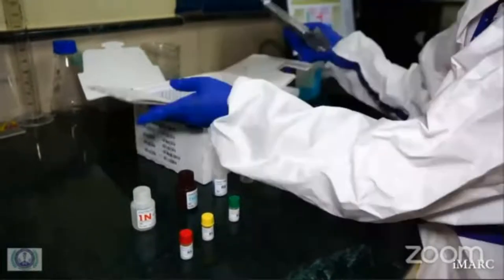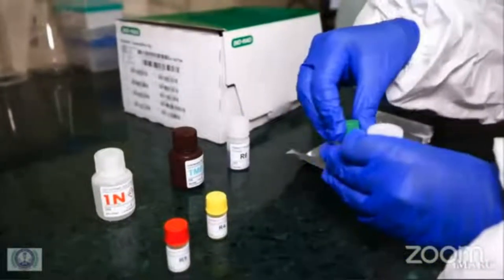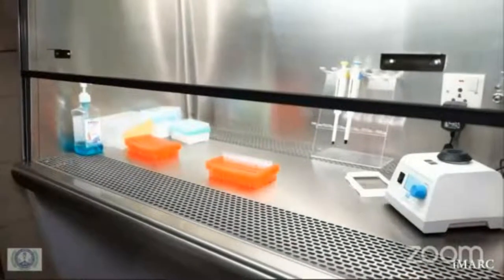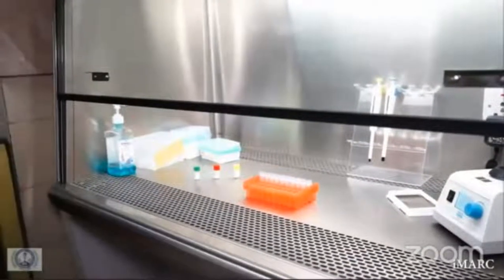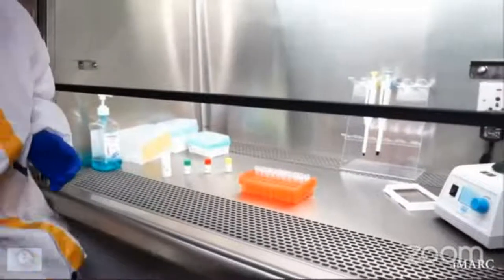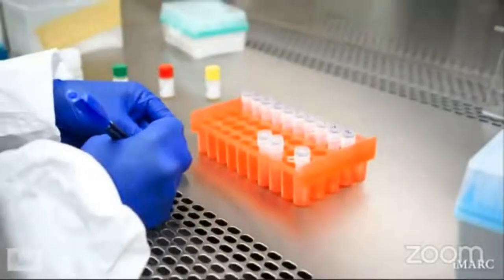Before starting the test, the Platelia galactomannan kit should be taken out and allowed to come to room temperature. Do not use the reagents beyond their expiry date. The components consist of R1 to R10 labeled reagents. The galactomannan kit is provided with three quality controls: R3, the negative control, R4, the cutoff control, and R5, the positive control. All the quality controls must be processed at the same time as the test samples.